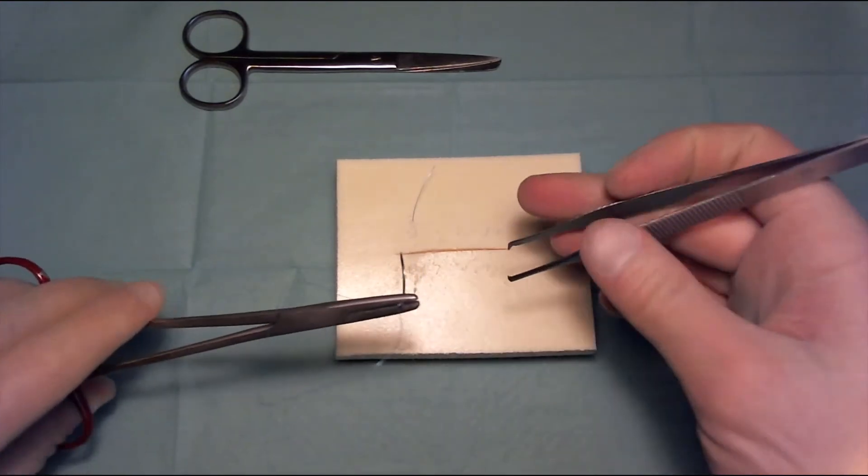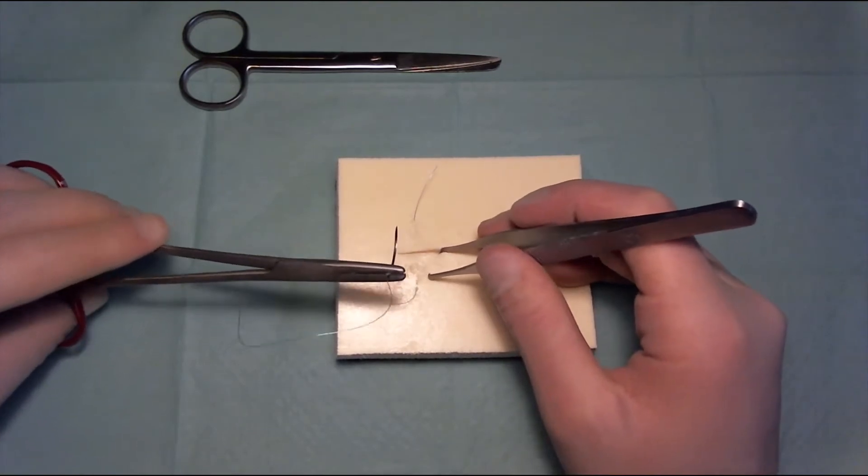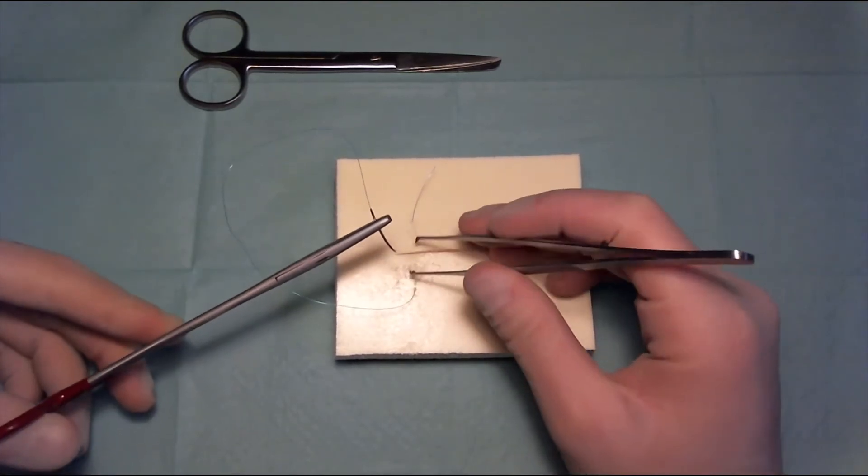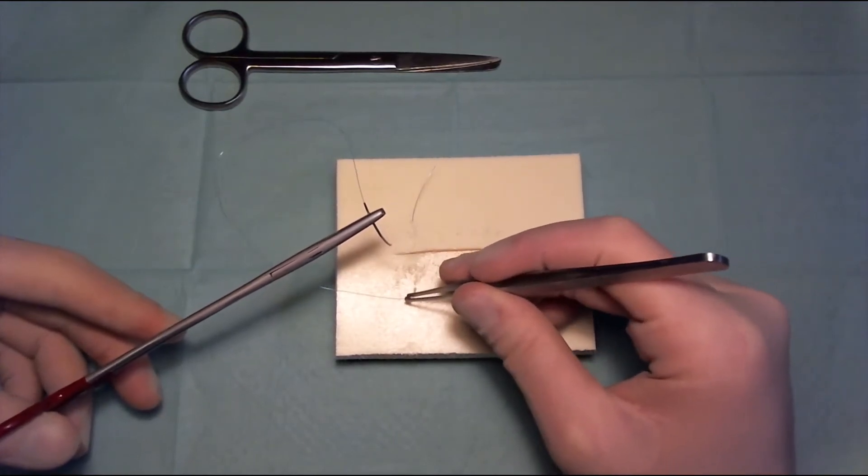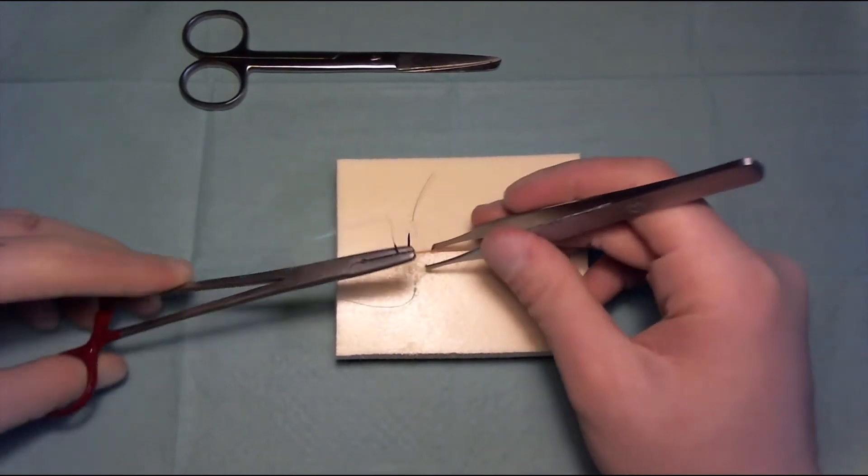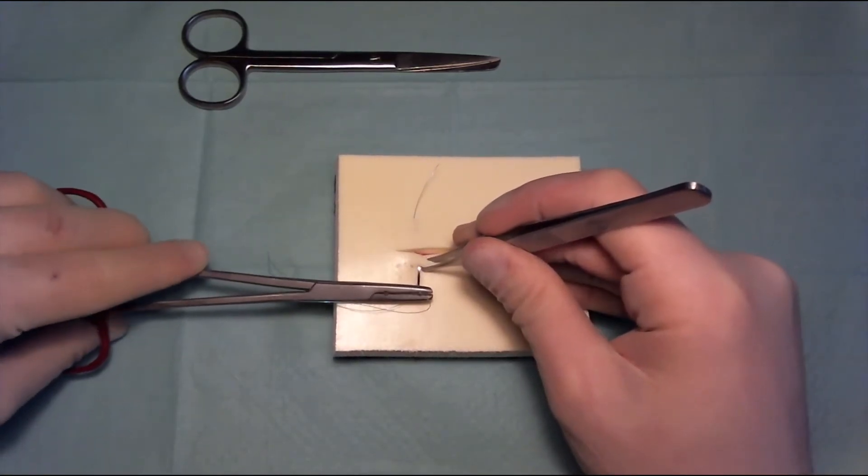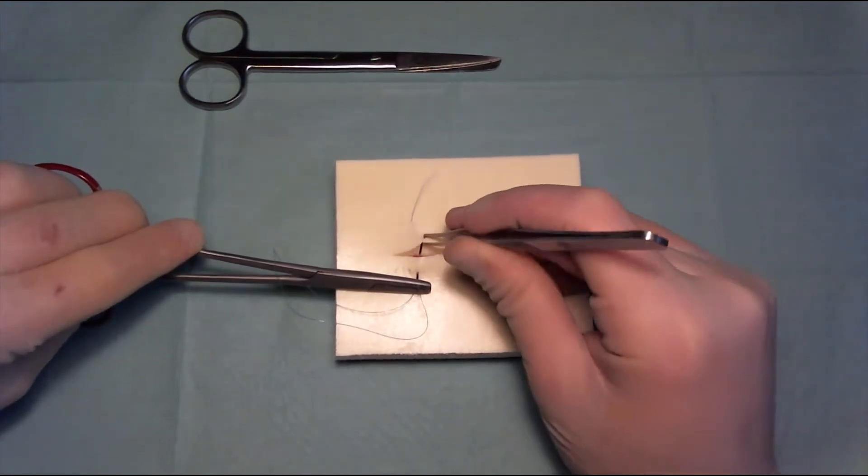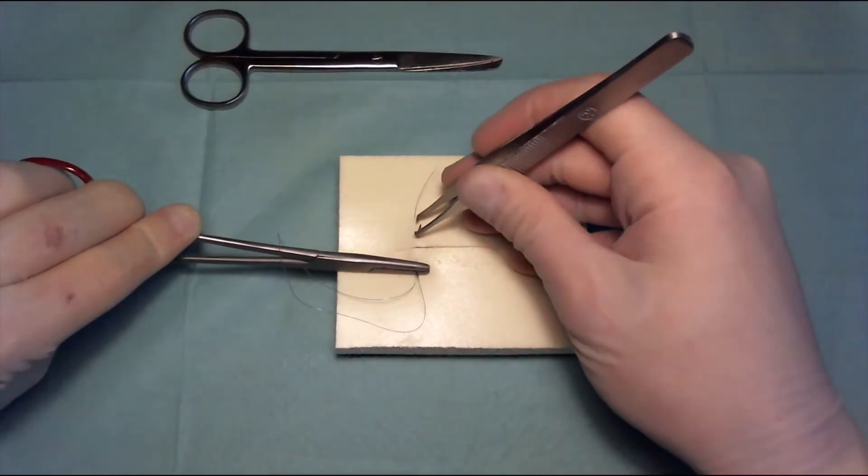This is backhand, so now we're going to do another simple suture but between the legs that we already have. This is our long leg, this is our short leg, and we're just going to do a simple interrupted suture between those two.